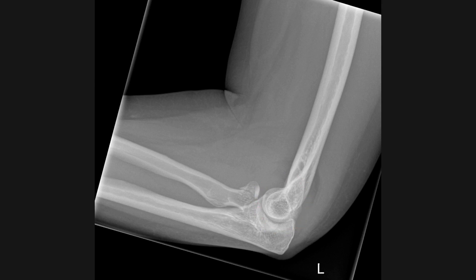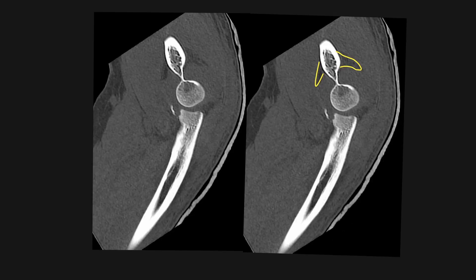This patient underwent a CT scan which nicely demonstrates elevation of the fat pad anteriorly and also posteriorly by the elbow effusion. Note also that this patient has a fracture of the coronoid process of the ulna.